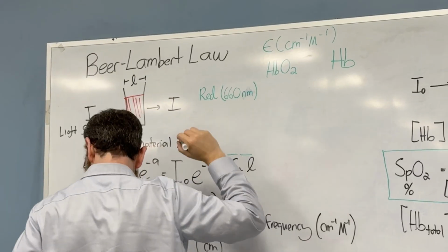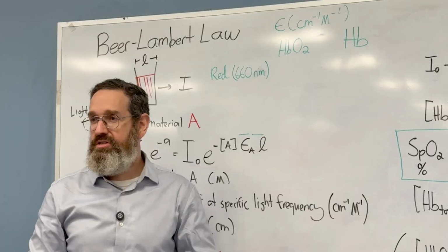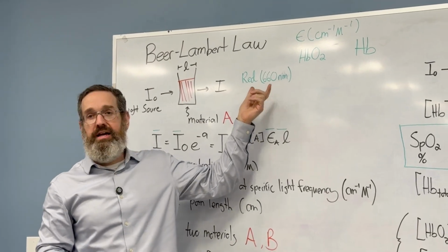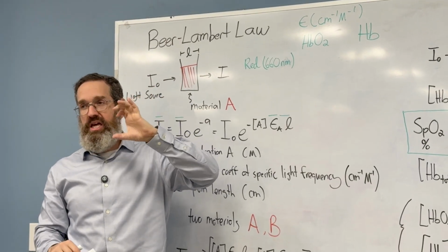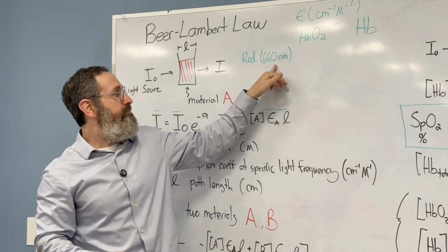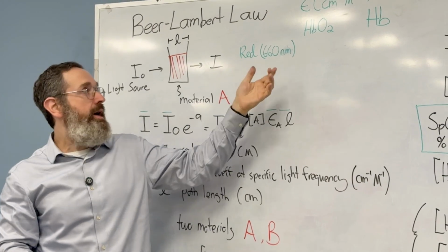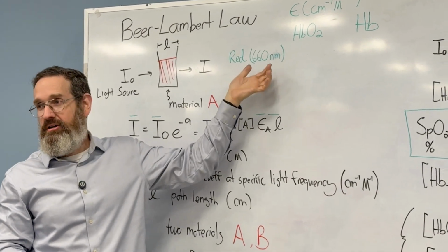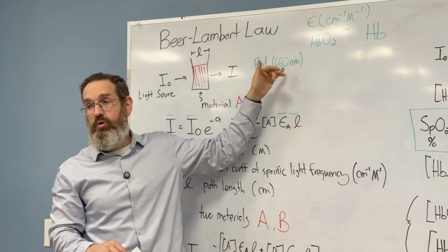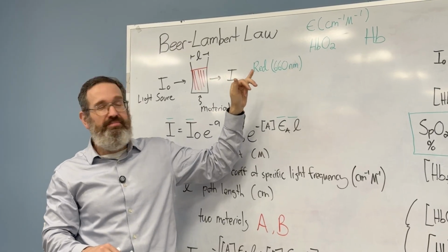Now, you're going to say, well, nanometers isn't a frequency. Frequency is like 10 hertz or 50 hertz, right? People will actually refer to this not as the wave frequency, but the wavelength. But it's directly related to frequency, all right? We're going to use this because this is conventionally how you're going to see it, but you should understand that this is an expression of frequency: 1 over this, with a speed of light correction.